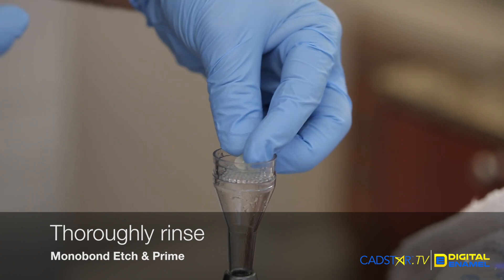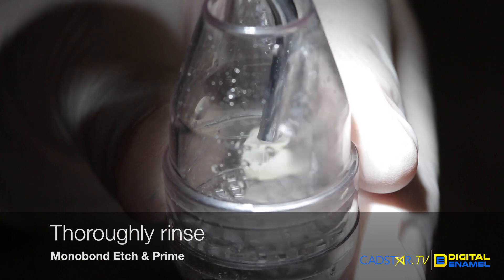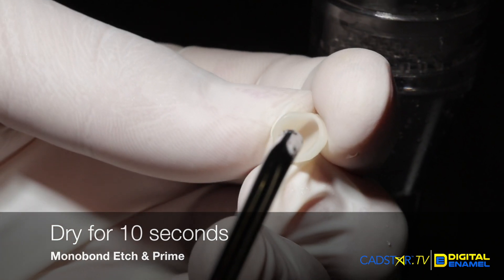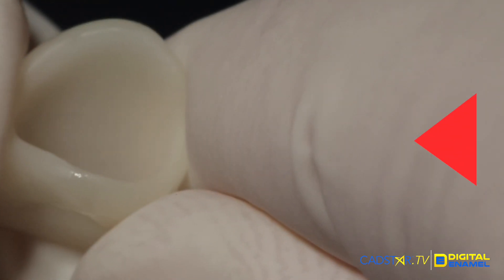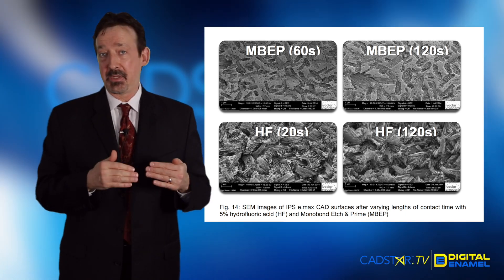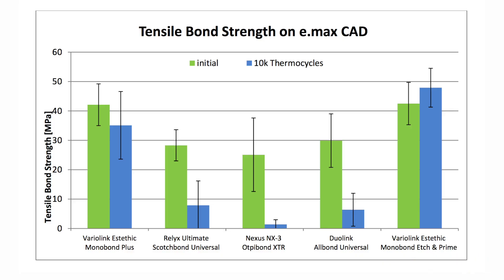As you would with hydrofluoric etch, you're going to rinse away the etch and primer — rinse it thoroughly. Then it's really important to dry for 10 seconds. When you look at the internal surface, it will have a different appearance than hydrofluoric etch — it doesn't look as etched. But if you look at the research, the adhesive qualities using this product on the ceramic are exceptional. Once you dry it, the silanation process happens and you're ready to bond.